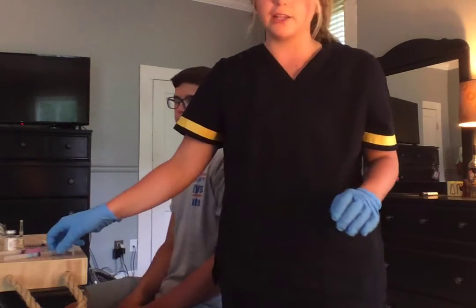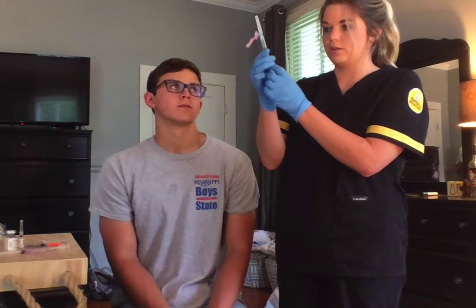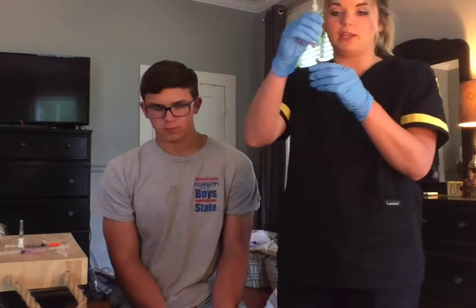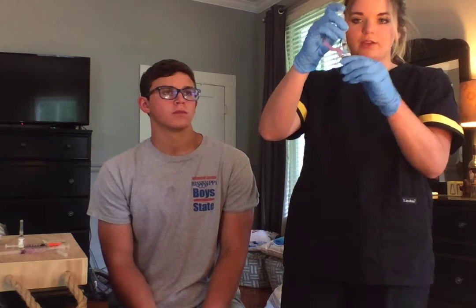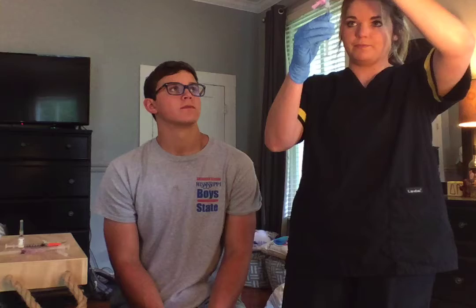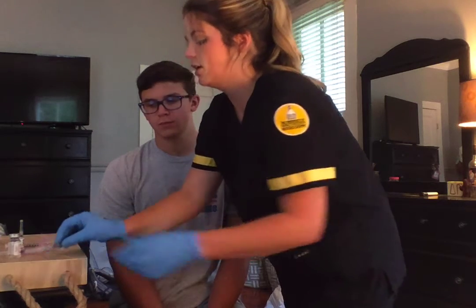And now I will be doing the ondansetron. I will be giving 4 milligrams, which is 2 milliliters. I'm going to take the 3 milliliter syringe and pull back to the 2 milliliter mark. So I've pulled back to the 2 milliliters. I'm going to carefully remove the cap off of my needle, take the ondansetron vial, and stick the needle into it. I will then push the 2 milliliters of air into the vial and turn it upside down until I have medicine at the 2 milliliter mark. So my medicine is now at the 2 milliliter mark, so I can pull this out. I'm going to put the cap back onto the needle and set it aside for a moment.